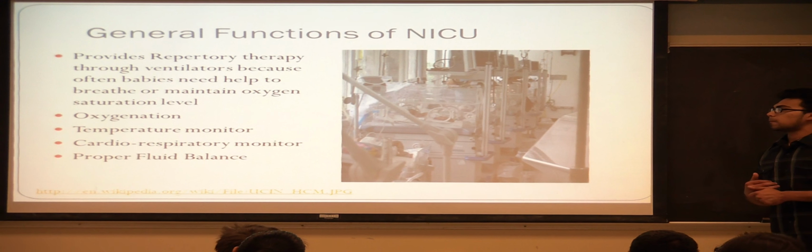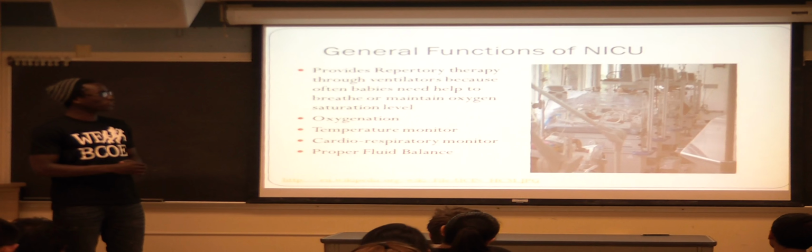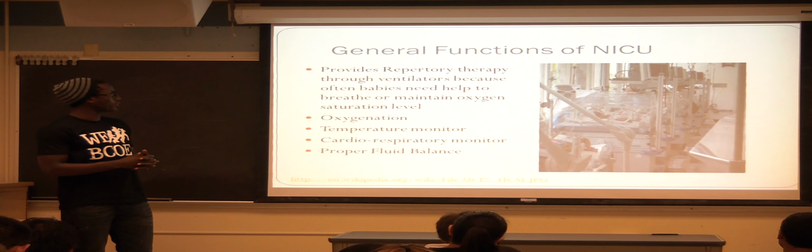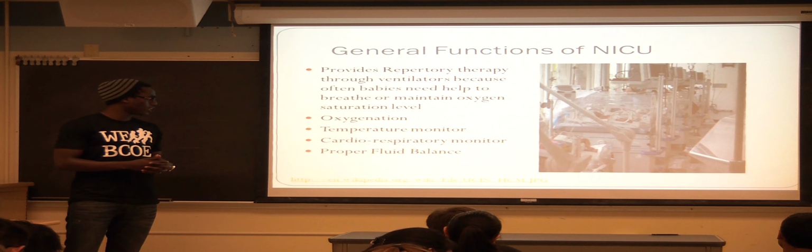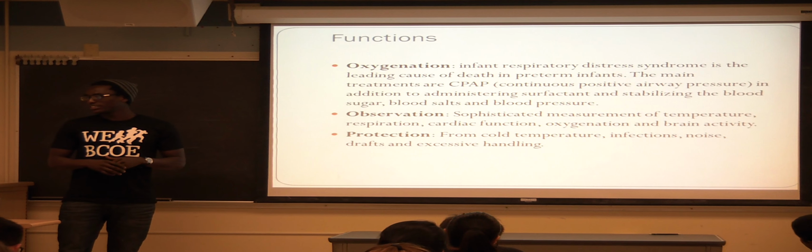These are the general functions of the NICU, and I'm going to go into more detail on them. As you can see, it provides respiratory therapy, which is oxygenation, temperature monitoring, cardiorespiratory monitoring, and proper fluid balance. These are the functions in detail.